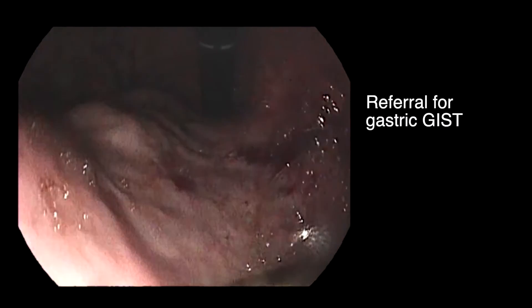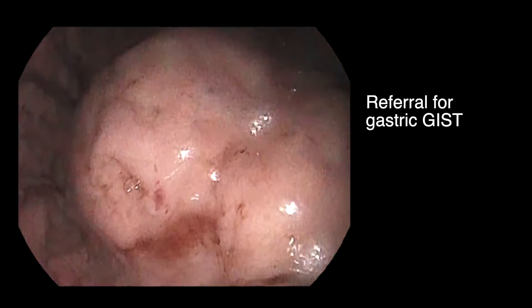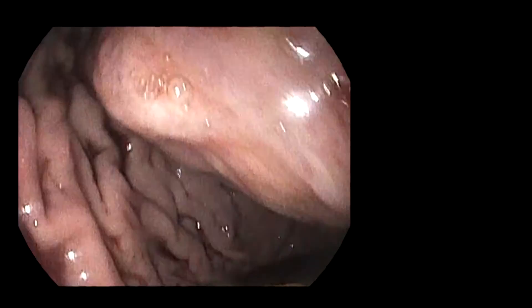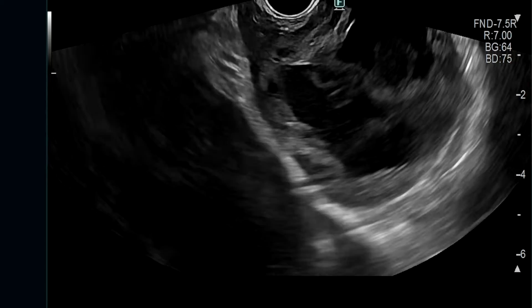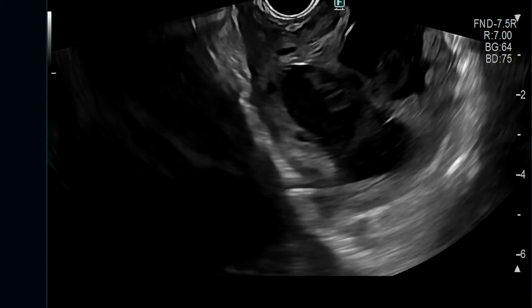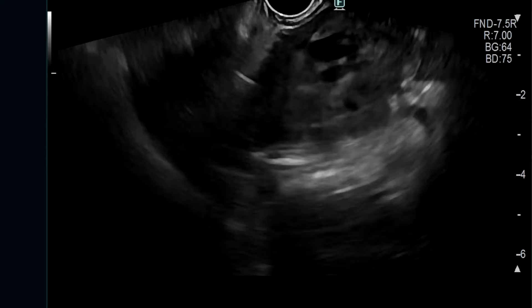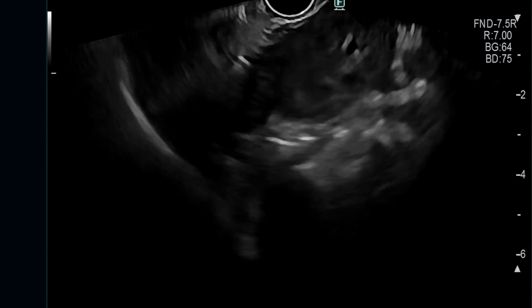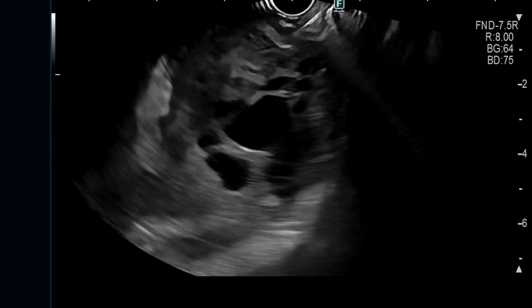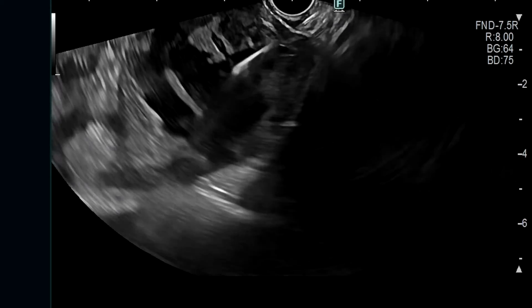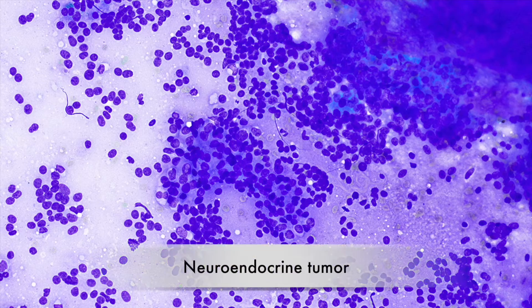This 55-year-old patient with dyspepsia was referred for evaluation of a suspected GIST lesion seen on retroflexion. On EUS, a complex mass was seen to originate from the muscularis propria layer of the stomach with solid and cystic spaces, suggestive of a GIST. However, fine needle biopsy revealed this to be a metastatic neuroendocrine tumour.